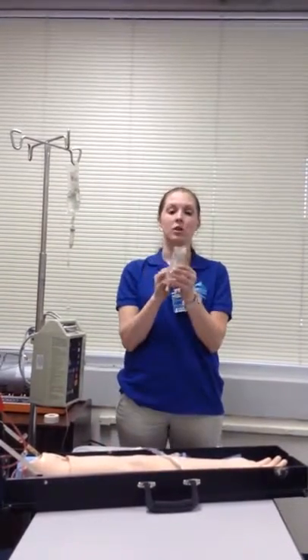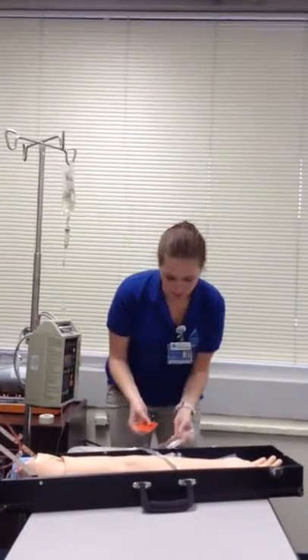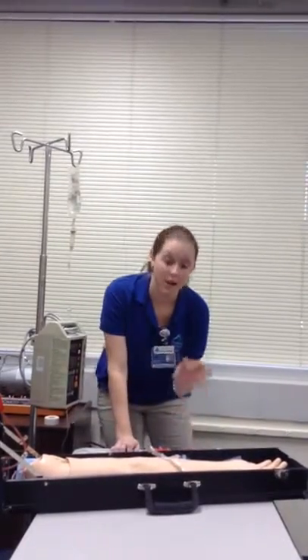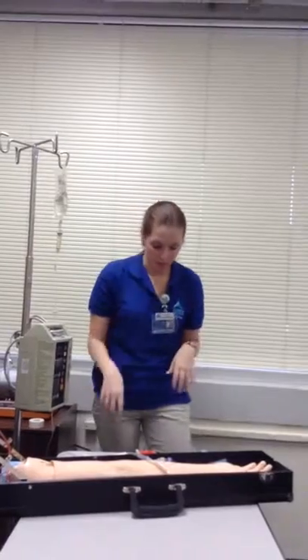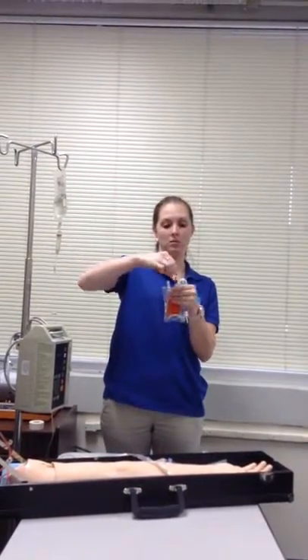I have my sodium chloride. What I'm going to do is I'm going to label it. So I would label it with the Flagyl, and the amount being put in, the date, the time, my initials, the patient's name, the start time, and the flow rate.